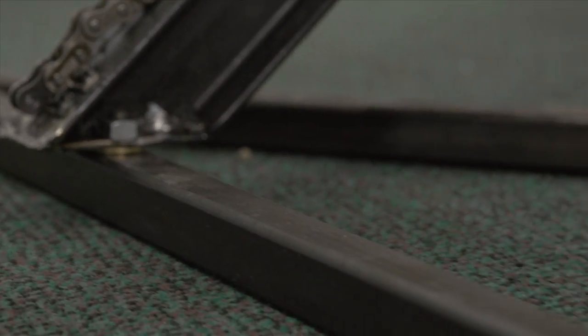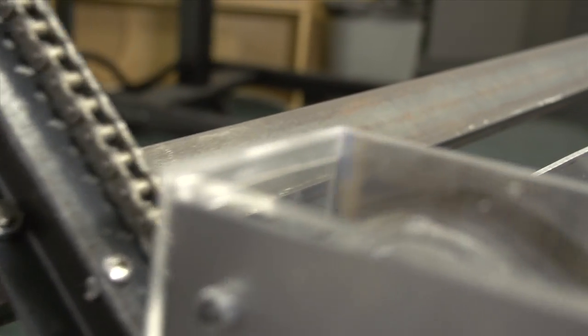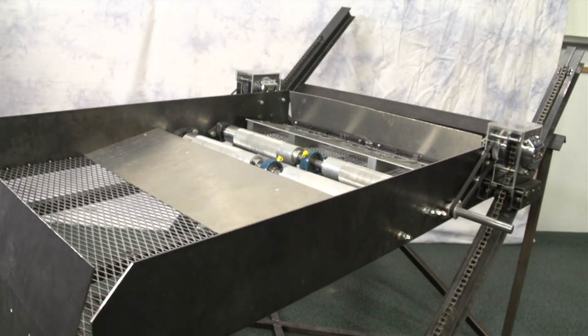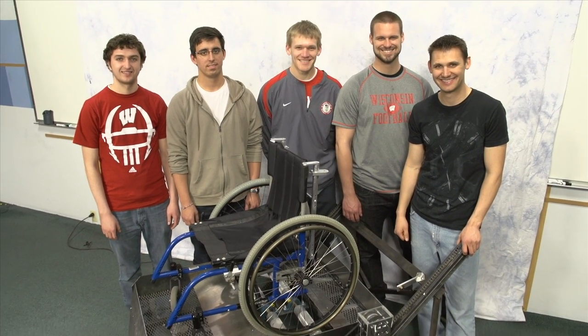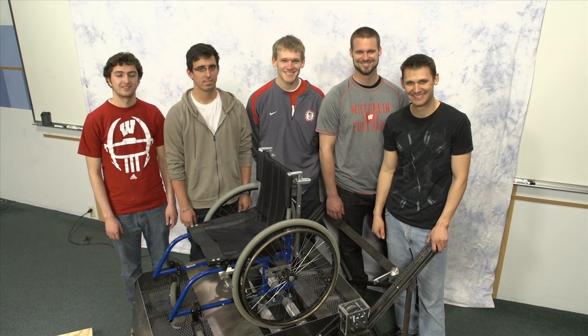Another benefit of the funicular is that it requires very little installation. The two rails are simply bolted to the staircase using four bolts, one at each end of both rails. Other features of the funicular are that it can be implemented inside or outside and it does not require a second person to operate. With all these benefits, the funicular still provides a cost-effective and compact solution for wheelchair users to traverse a staircase.